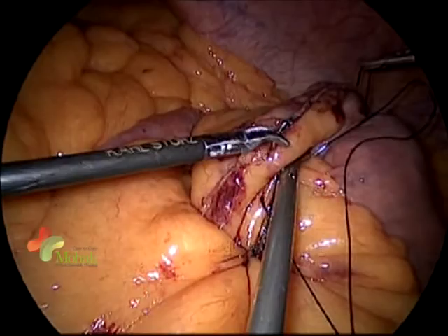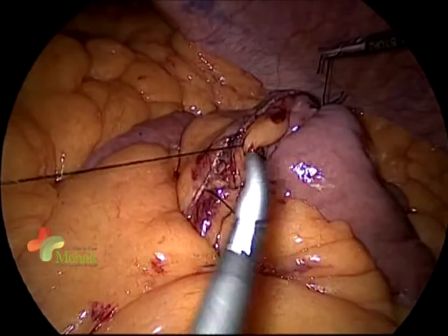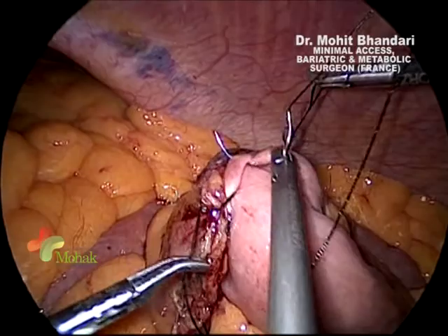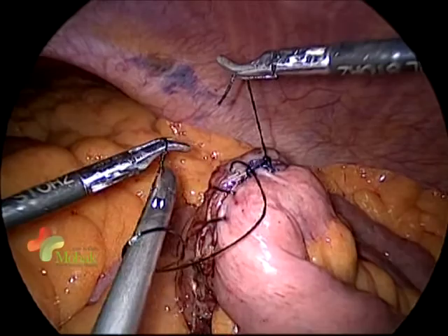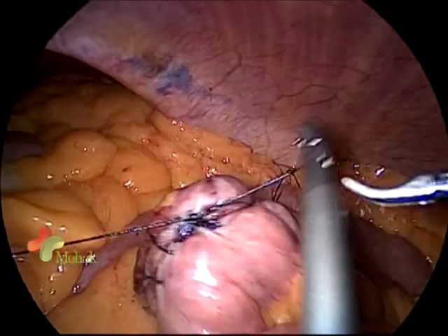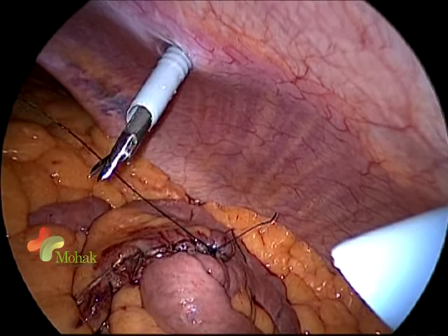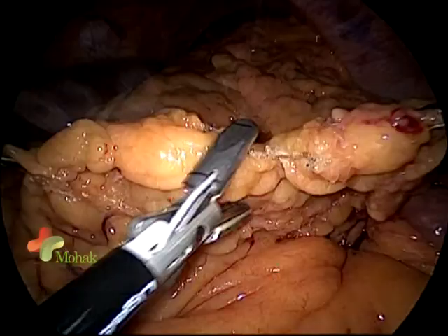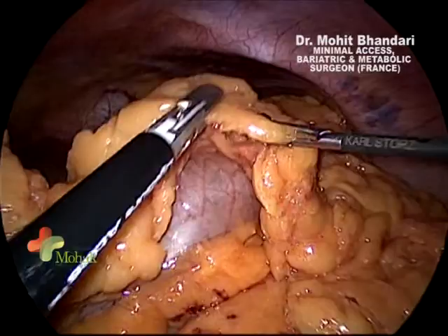The trick here is not to take too deep a bite — just 1.5 centimeters deep — so you do not damage any vasculature. A hematoma or bleed at this place can be very dangerous: it can compromise the blood supply and lead to intra-abdominal abscesses, especially in diabetic patients. The suture line should go all the way up, leaving no single defect. Internal hernias have been reported even years after bariatric surgery, so it is better to avoid them by thorough closure.